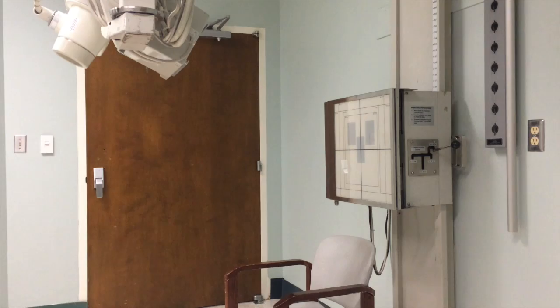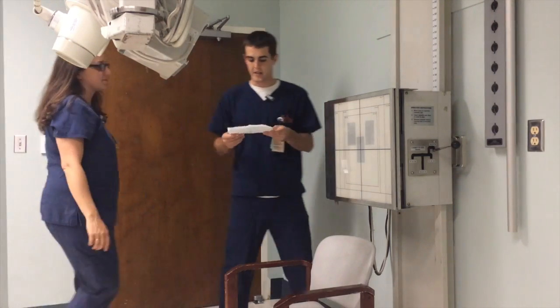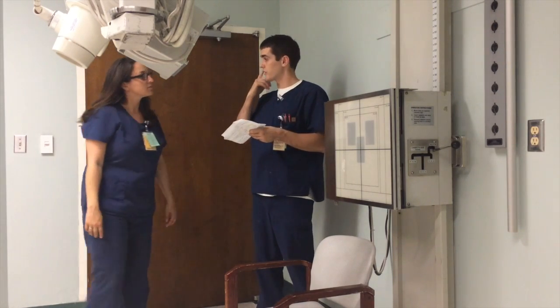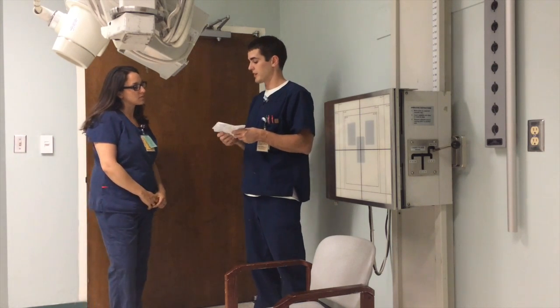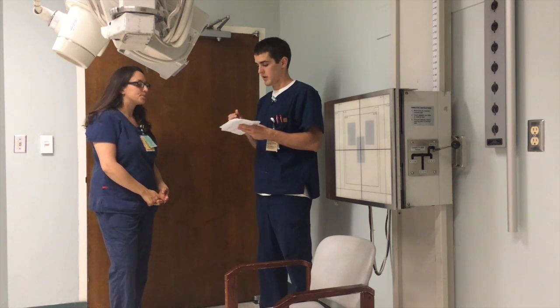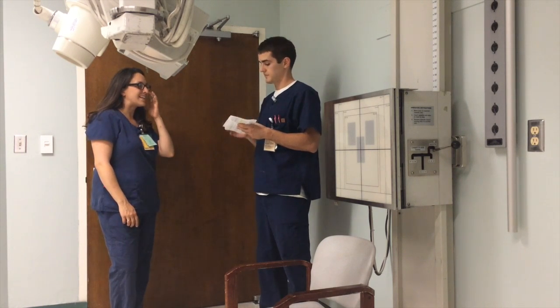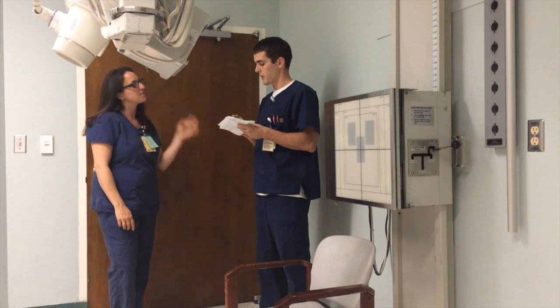Marissa? Yes. How's it going? My name is Dustin with Radiology. We're just going to be taking 3 images of your zygomatic arches, it sounds like, of your face. First off, could you verify your first and last name and date of birth? Marissa Oliver, 7184. Perfect. And any chance you're pregnant? No. All right. So what happened? I got hit by a softball on my left cheekbone area.